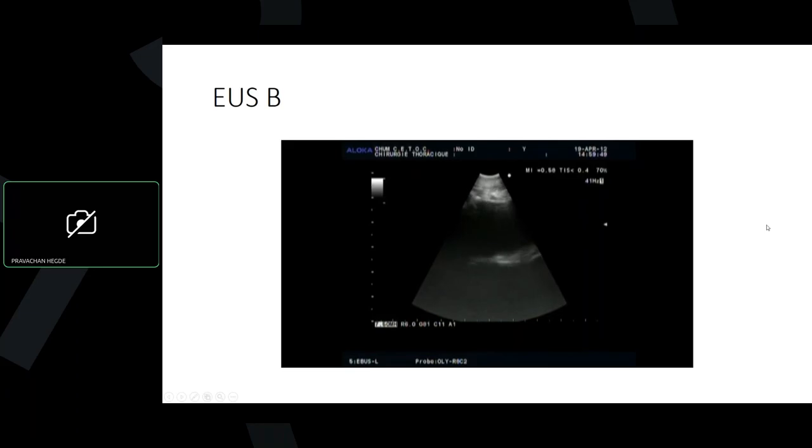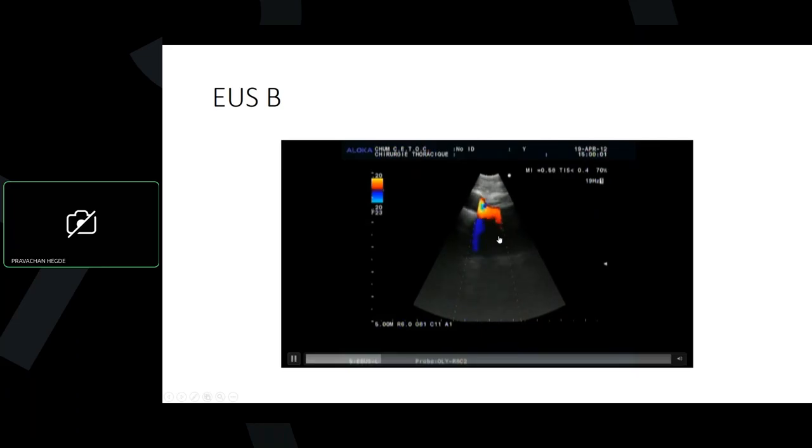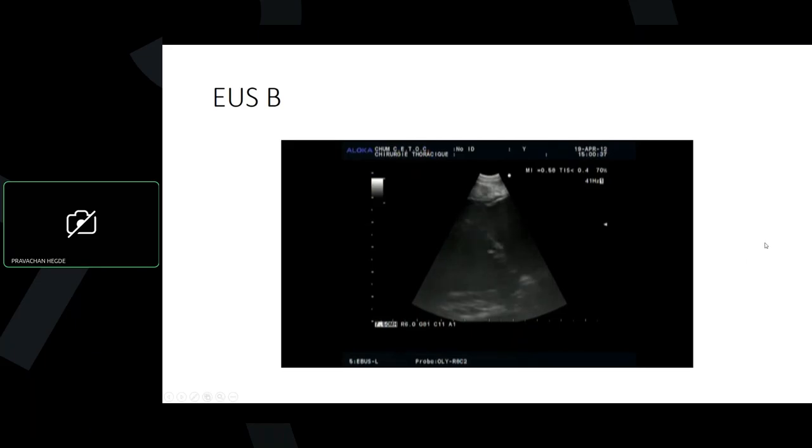So this is the aorta, and then the celiac axis here, the branch taking off, and celiac axis lymph nodes are right here. We are in the abdomen here. As you can see, the aorta looks like a large pipe, and then you saw the celiac artery take off from there as well.